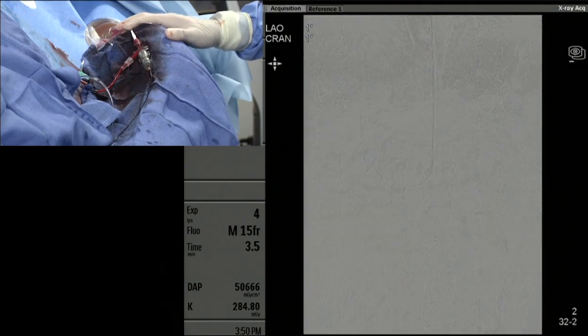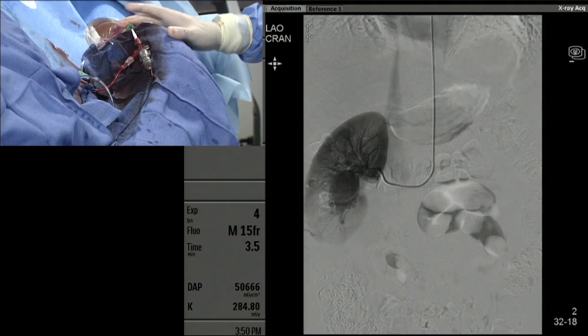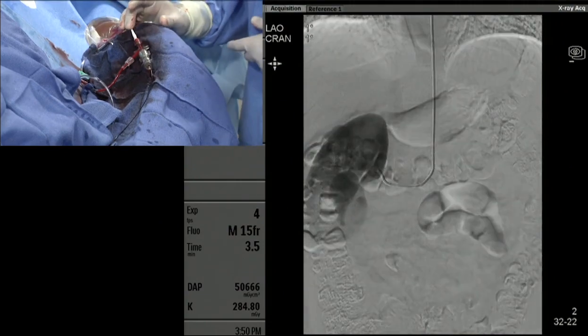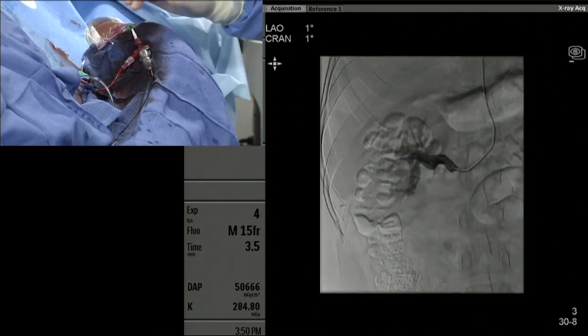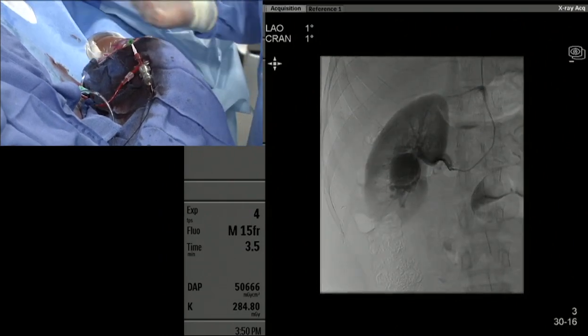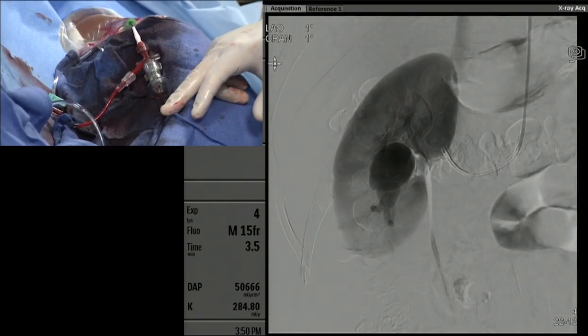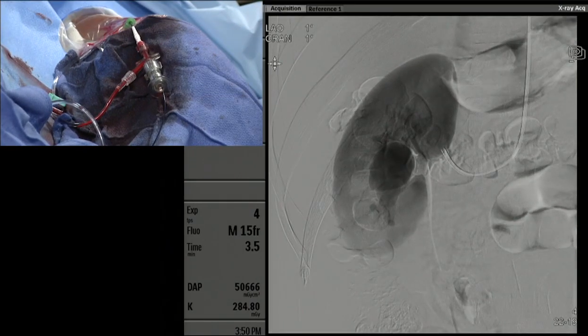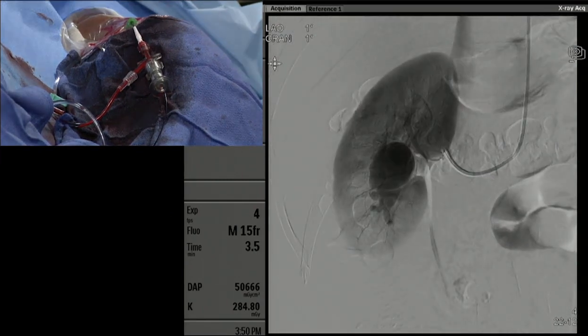And so at that point, since we don't really know exactly how we're going to embolize this yet, we switched out over a Benson wire for this Concierge guide catheter. This is a 6 French renal double curve. So you can see it here on the wrist. It's basically hub, but it's all the length we really need. So through that, we have a 2.8 Prograde. It's a 150, so this will allow us to put in liquid embolics and different types of coils. And then we use that to cannulate that lower pole branch.